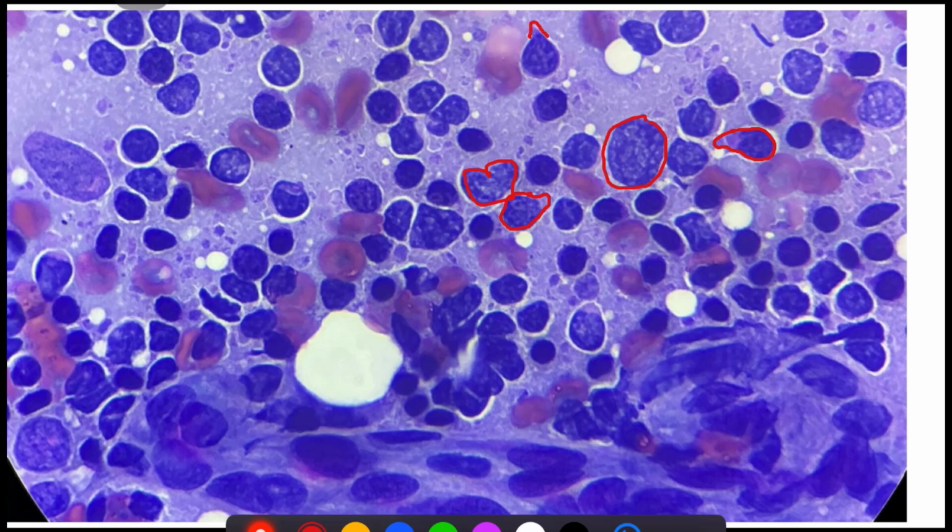So if you have a lymphocyte with a cytoplasmic process like this, it may be T cell type, right? So B cell and T cell, it is difficult to differentiate. And here this is the capillary or endothelial cells, endothelial lining, right? And here this is the follicular dendritic cell.